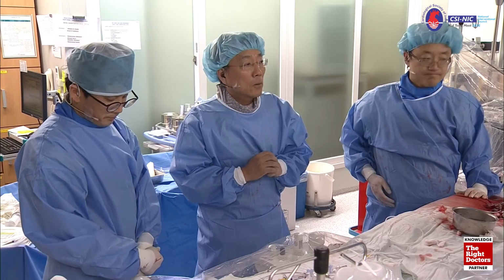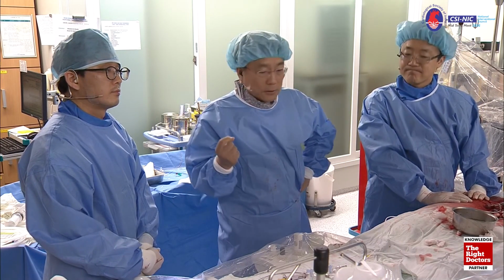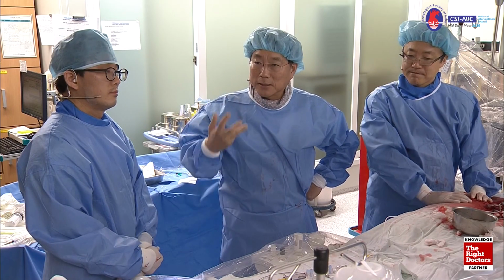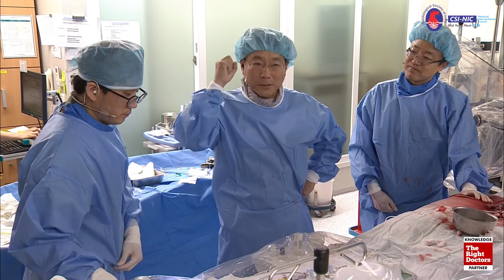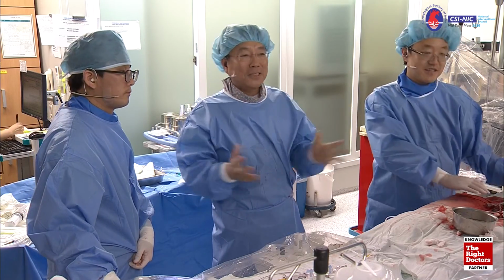So, I would like to really tell you in terms of stent areas, that is the most important predictor. How big it is, 5, 6, 7, 8. That is our data. All right. Okay.